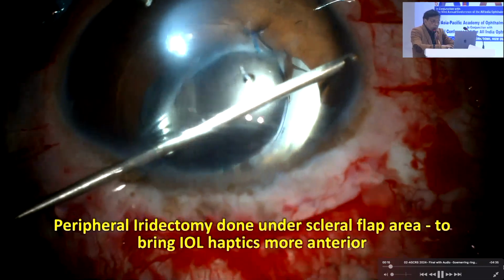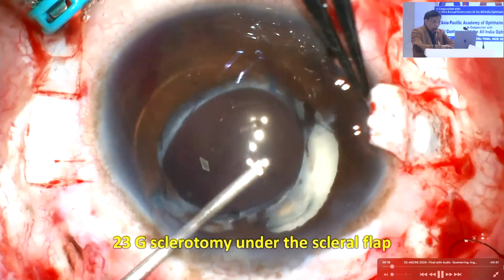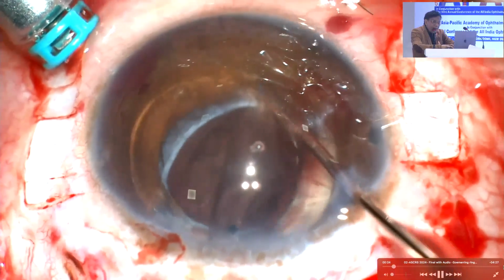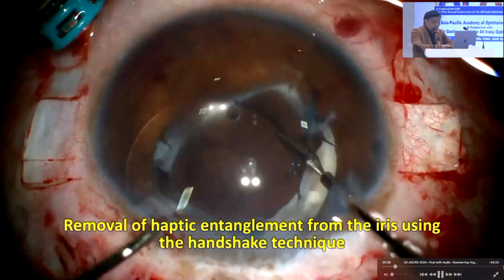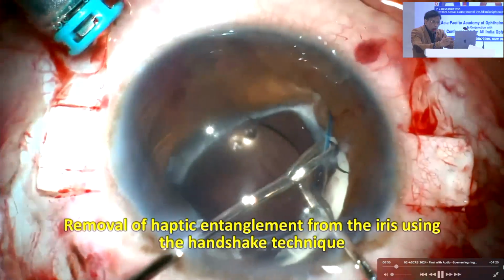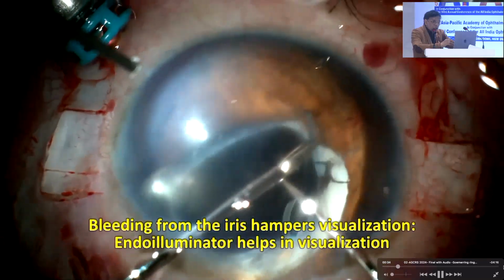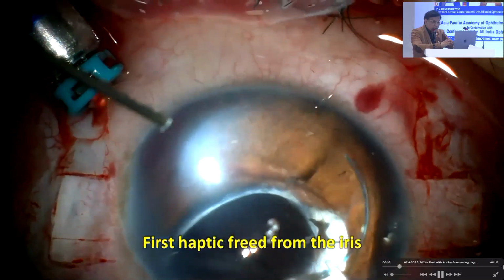So let's see what we do. You see, this is a large eye, and a trick I tell everyone here is, when you have a large eye, do a small peripheral iridectomy. The reason is, you can come more anterior when you make your sclerotomy. Now look at that IOL, it is stuck to the iris also, because this has happened some years later. Now I have dislodged that haptic from the iris slowly using the handshake technique.